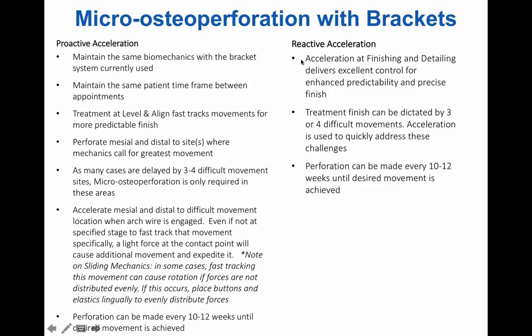Now the reactive technique means that you would use microperforations at the finishing and detailing, which would really help increase your control at the very end when you're tweaking the procedure, trying to get those last few teeth into position. So again, just like with all cases, 3 or 4 difficult movements can be the factors that are keeping you from finishing a case. If you focus on those areas, you can bring those teeth in line a lot quicker. So these are different ways that you can approach micro-osteoperforations in your practice.